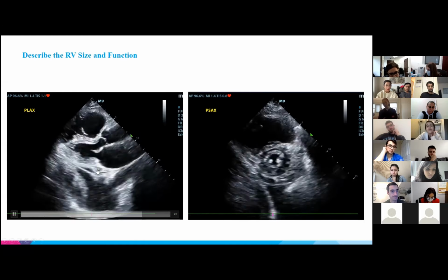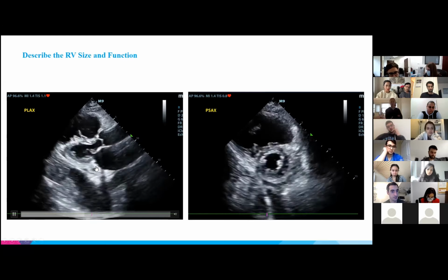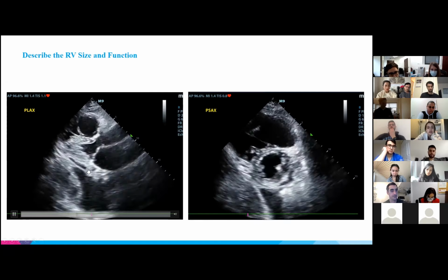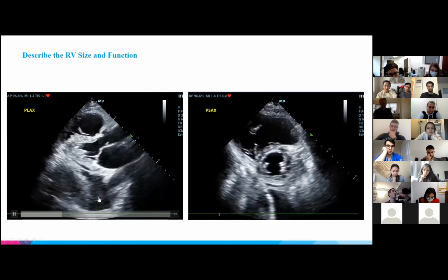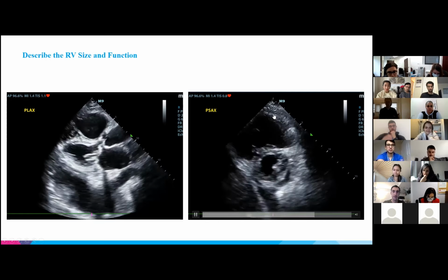This is actually a coronary sinus, which we usually can't see that well at the bedside, but you can see it in this lady here. And this rim of black right here would be the example of a small pericardial effusion. And then this black here would be pleural effusion. So she has both, I would say. And then what do we think of the parasternal short axis?